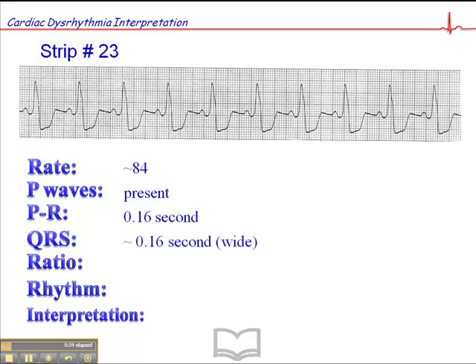Now we have a QRS which is most definitely wide — 0.16 second. The QRS begins about here and ends about here. Now what's all this stuff from here on? It's probably ventricular repolarization. Whether you measure from here to here or from here to over here, we have a wide QRS without a doubt. But somewhere in here has to be ventricular repolarization of the T-wave. So this is probably the T-wave here, and that's probably the end of the QRS there. So it's at least 0.16 second wide.